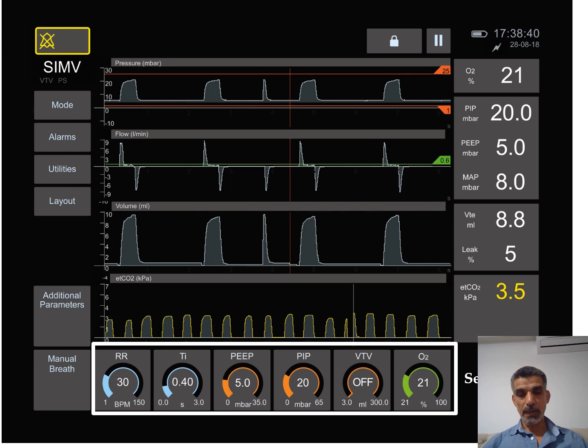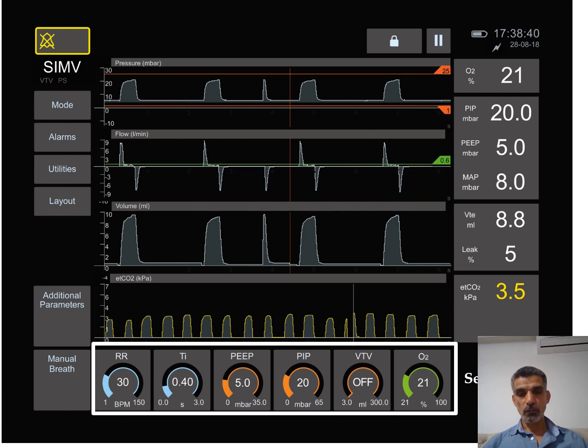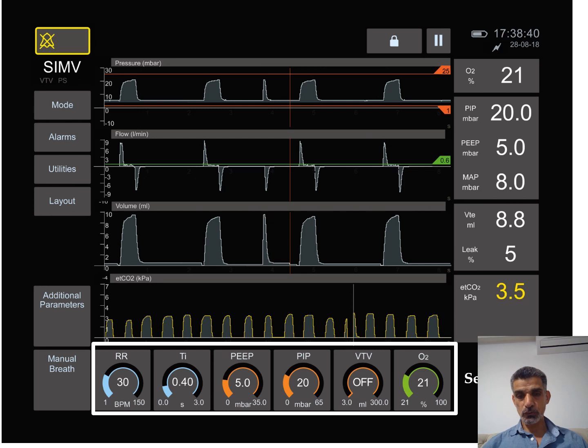We also can add to the ventilator what we call volume targeted ventilation, where we tell the ventilator how much tidal volume goes inside. We also set how much oxygen. Here it's in room air, but we can go up to 100 percent.